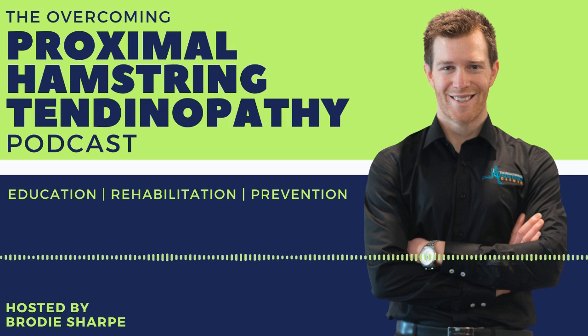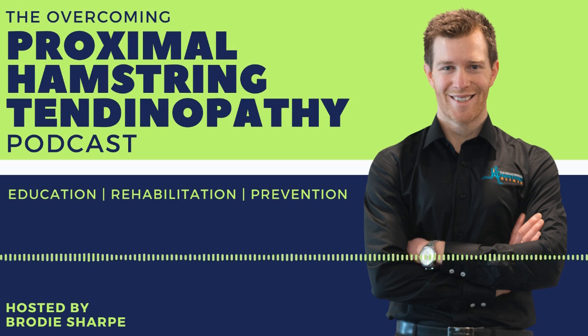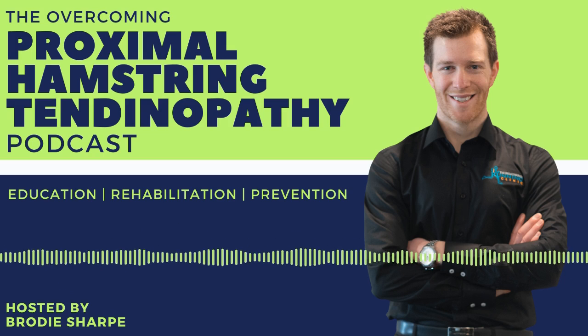Upper limb is different from lower limb. For lower limb tendon, which is what I see with runners, right from the beginning when I teach courses, I make it very clear. It's a second line of treatment. It's not something you give when you have pain or symptoms. So I've never given anyone Shockwave if the symptoms are less than 3 months.